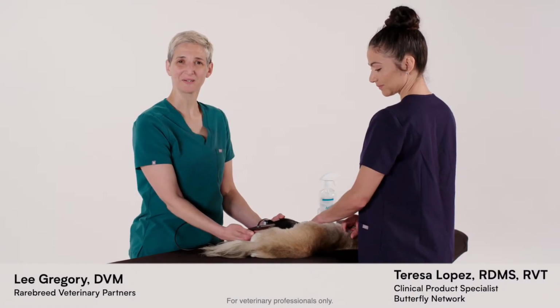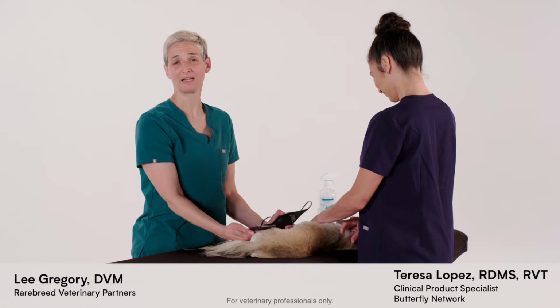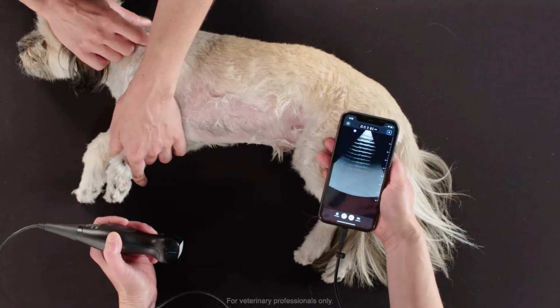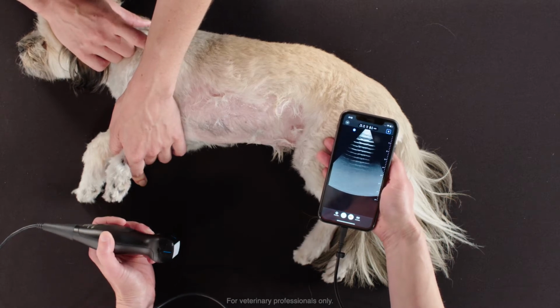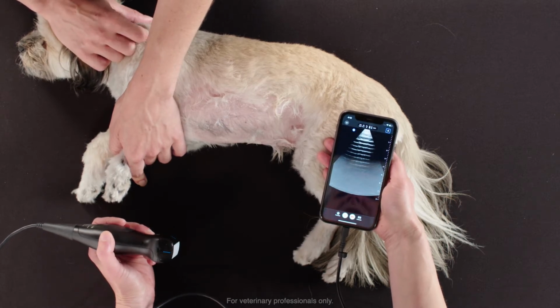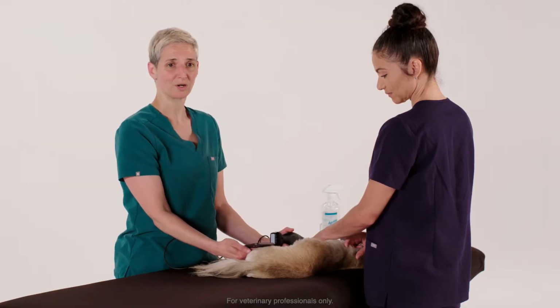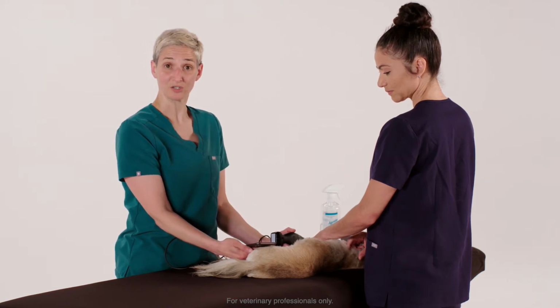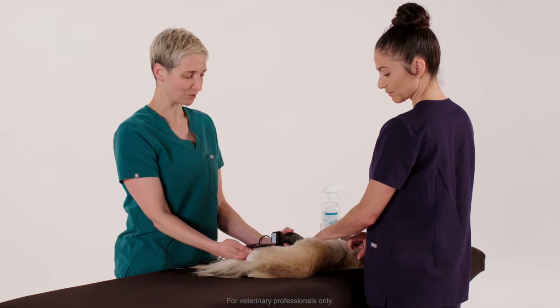I'm Dr. Lee Gregory. We're here with Teresa and Luna using the butterfly to begin our limited ultrasound exam of the abdomen. Luna is already in right lateral recumbency, pretty typical position for limited abdominal ultrasound. And we're going to be using limited abdominal ultrasound really for the patient that comes in that is either a triage situation or has an abdominal process, an unknown abdominal process, and we're trying to figure out what's going on.